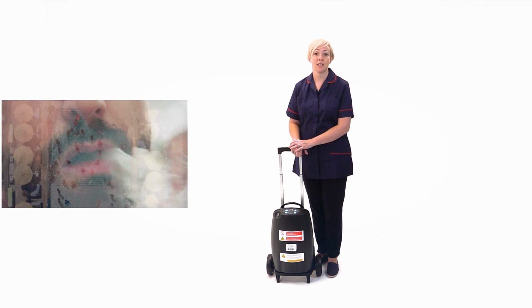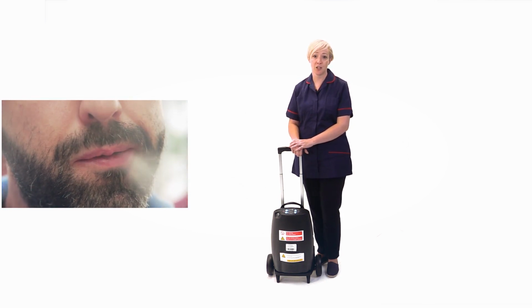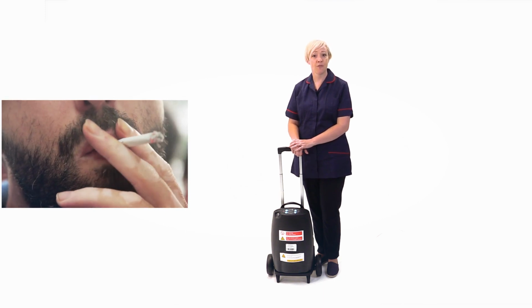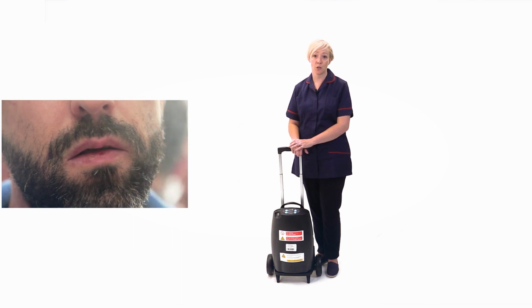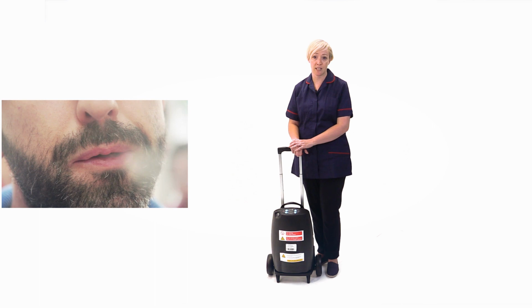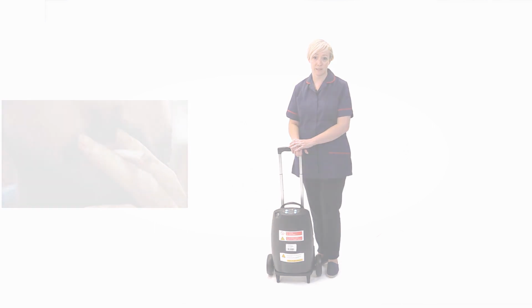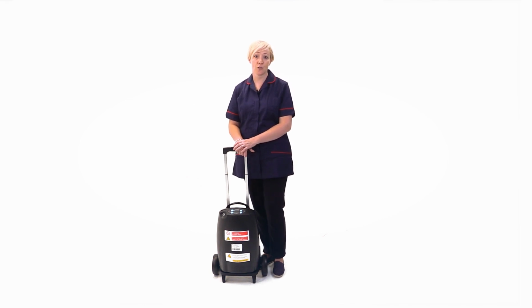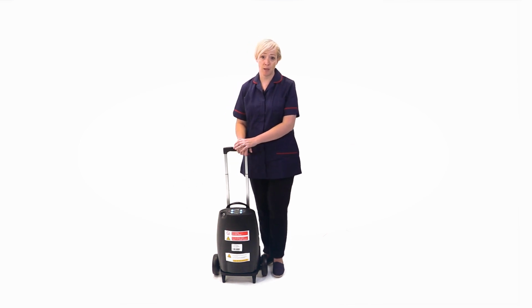Smoking around oxygen is extremely dangerous and may cause clothing, hair and skin to catch fire and burn more vigorously than in air. So therefore, you must never smoke or allow someone else to smoke whilst you are using your oxygen concentrator. This applies to smoking with traditional or e-cigarettes. I will now go over some problems that might occur with your concentrator, but if you have any concerns, then you should contact your home oxygen supplier for advice.